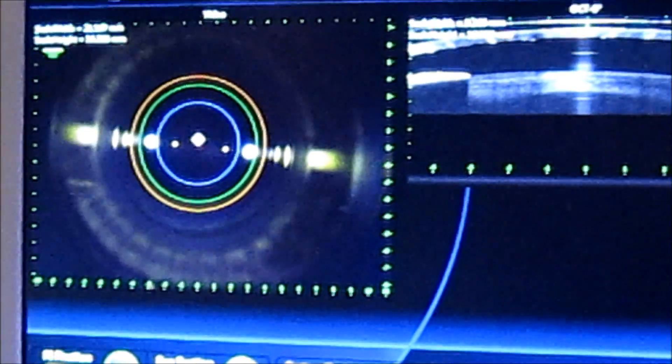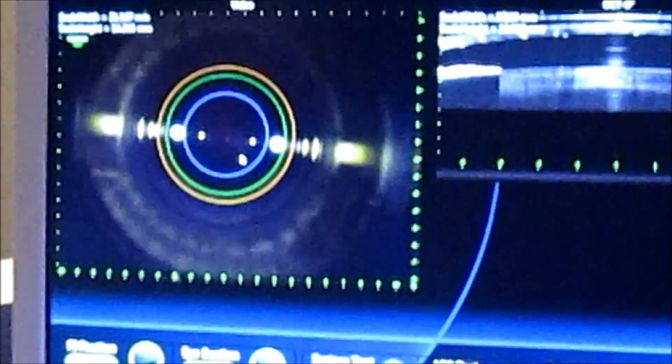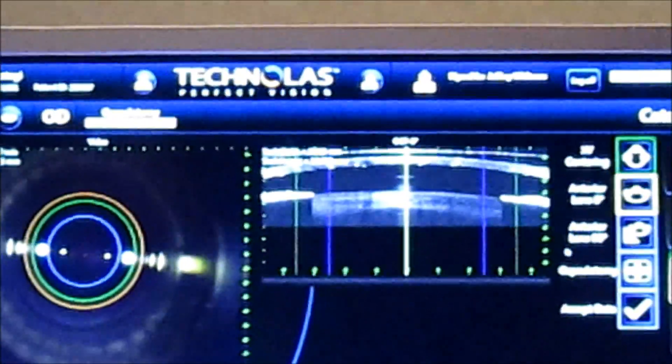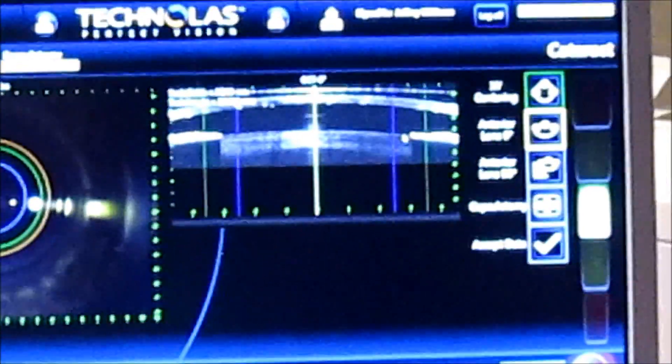We lock the ring in place by giving it a little squeeze. The pupil centration comes up and we can center the pupil. We can change the diameter if we wish. This is a 5.5 millimeter capsulotomy.